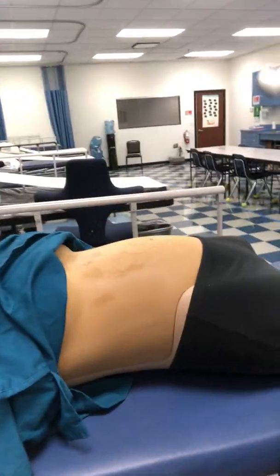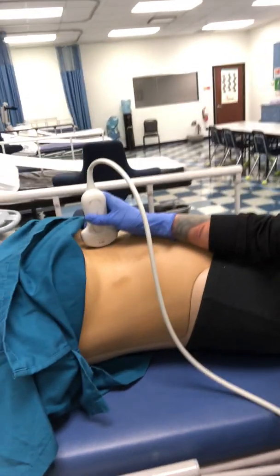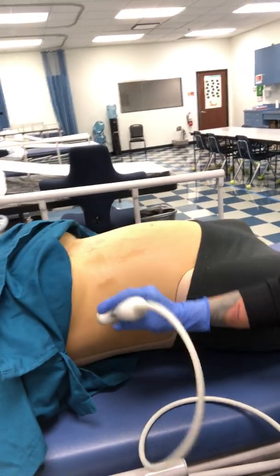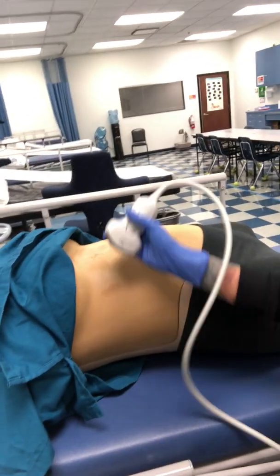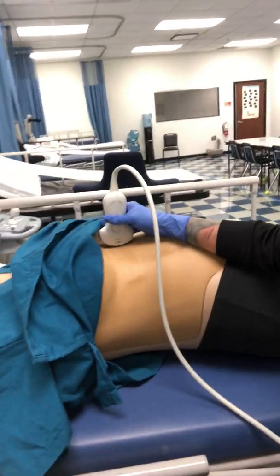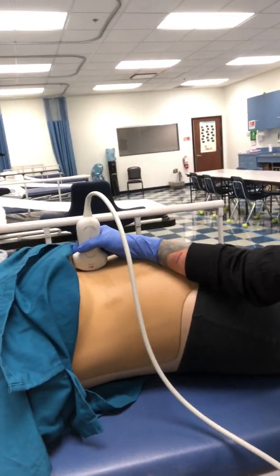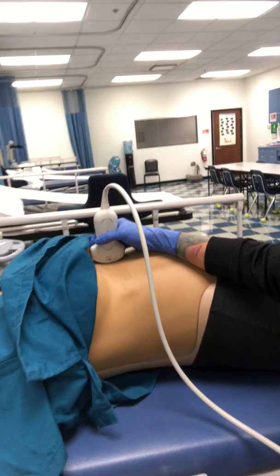Sometimes some of the probes have things on both sides. When in doubt, just look for the side that actually has more, and that's the notch side. If we have the patient in a supine position like we do here, you are pretty much only going to be able to scan either from the anterior position or from the coronal position. So we'll start with the anterior position in sagittal and transverse, and then we will move towards the coronal for a little bit of further explanation.